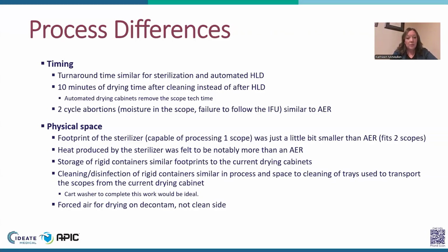From a physical space, it was also pretty similar for us. The footprint of the sterilizer, which holds only 1 scope in its current modality, is a little bit smaller than our AER. So we would need more space to hold 8 sterilizers if we were to completely switch away from our AERs over to sterilizers. The other small difference was that the sterilizer did produce a bit of heat. You could feel it as you were standing next to the sterilizer. So we noted for our future use that we would need to definitely address HVAC and have cooling abilities if necessary, with, again, the idea of 8 sterilizers in 1 room.